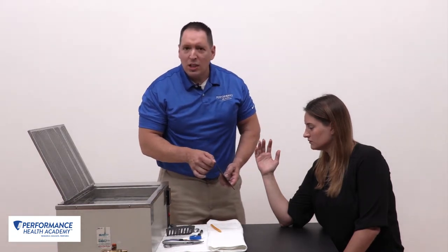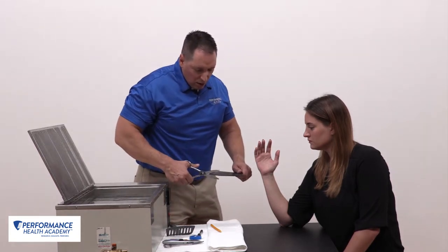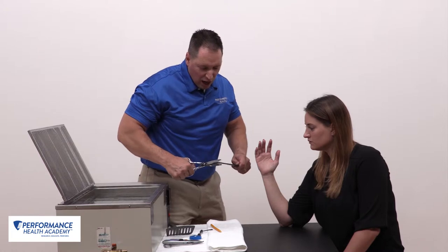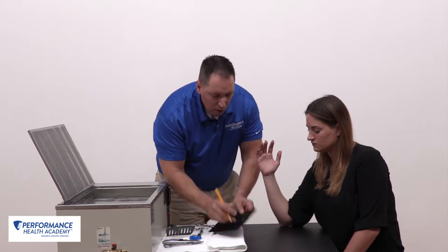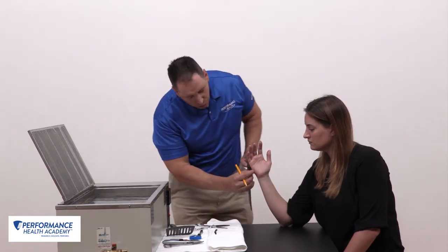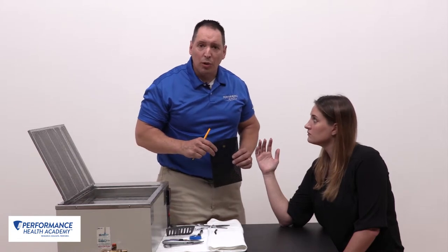I take a six by nine sheet of either sixteenth-inch or three thirty-seconds aquaplast micro-perforated. This is going to be radial based, so I'll trim about an eighth of an inch off each side. In the middle I'll place a little hole for the thumb piece. This will go over the thumb, down around the thenar eminence, and come along the ulnar border and pinch together. I'll let that dry, snap it off and trim it down — a very quick radial-based circumferential wrist support.